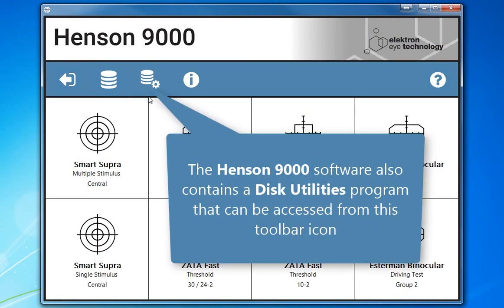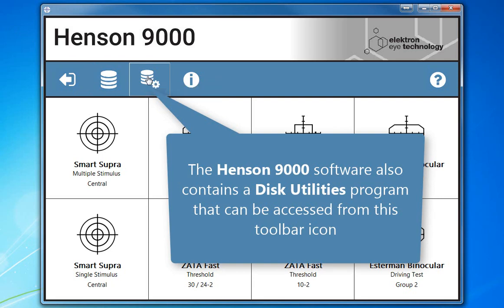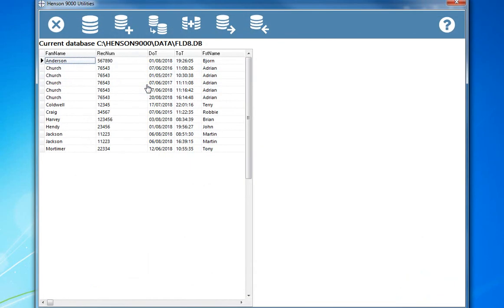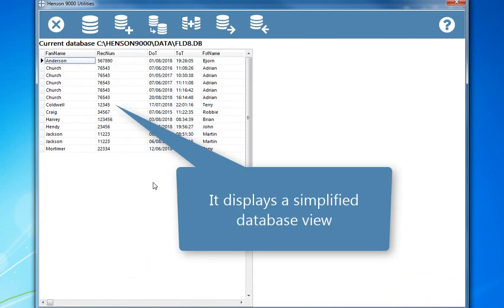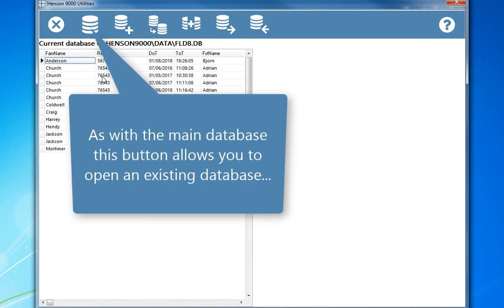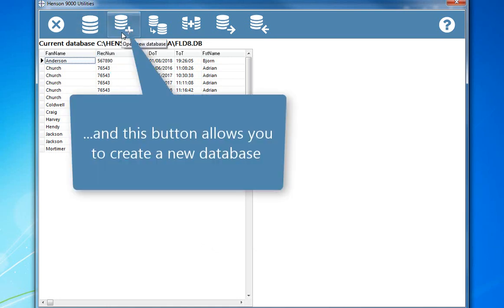The Henson 9000 software also contains a disk utilities program that can be accessed from this toolbar icon. It displays a simplified database view. As with the main database, this button allows you to open an existing database, and this button allows you to create a new database.